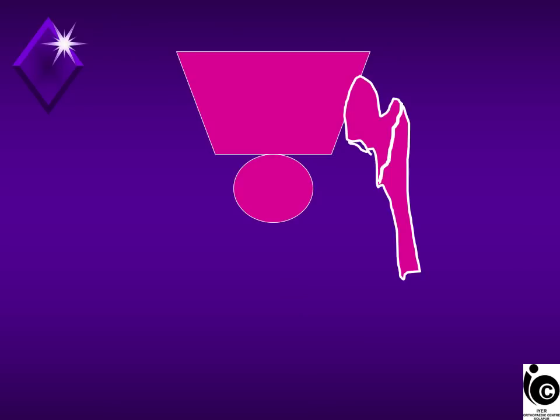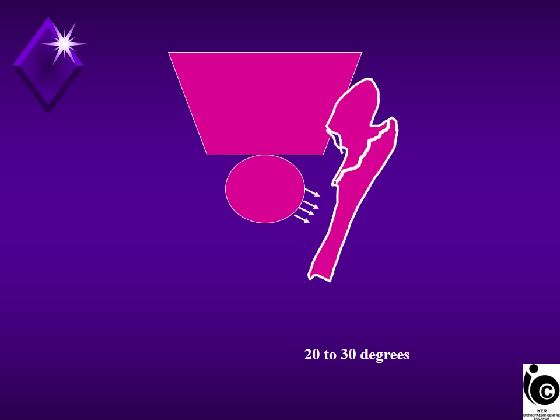This can be avoided by properly fixing the fracture. I will show how we should do it. Before that, I will show how this lateralization happens. Normally, a fracture is reduced well, and when the surgeon adducts the limb to make an entry, the thigh touches the perineal post.